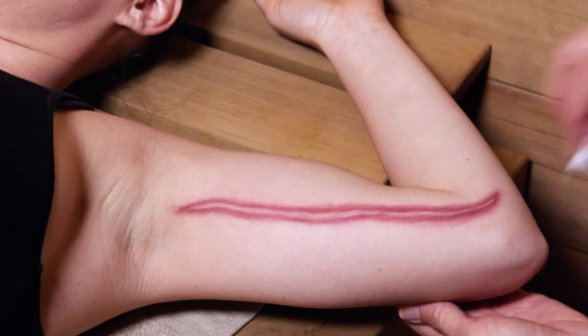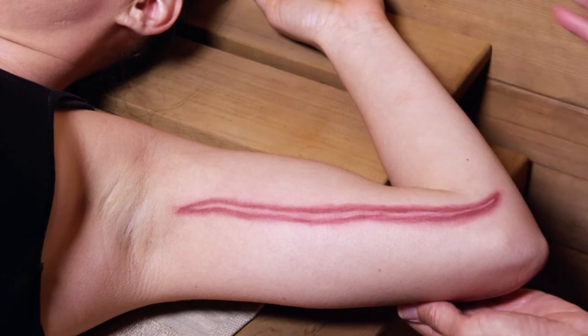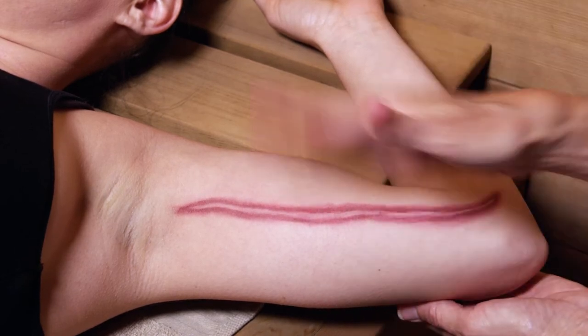Next, remove any oil or soap residue with alcohol wipes. Be sure to allow your skin to dry before applying Embrace.